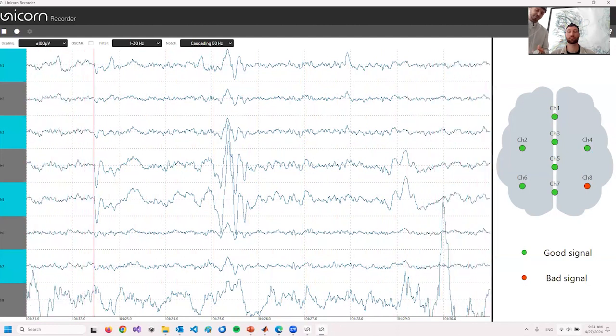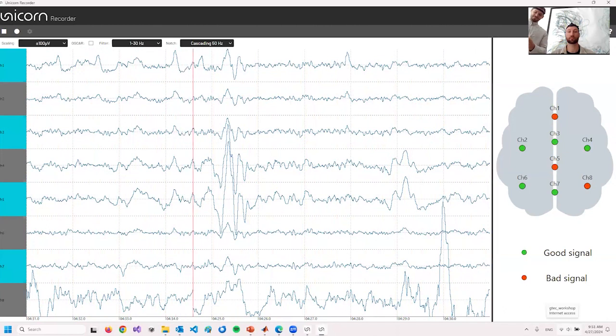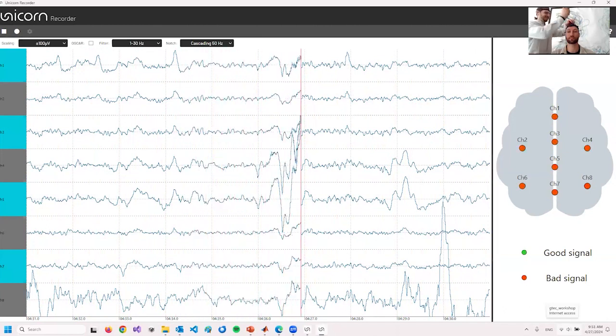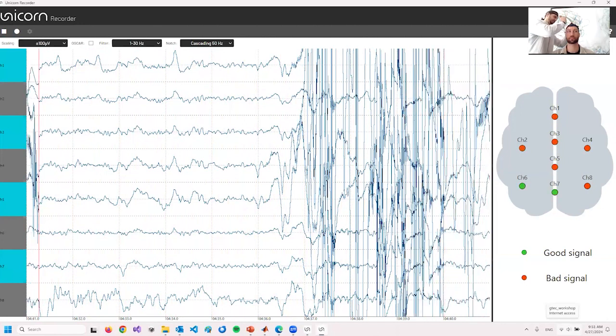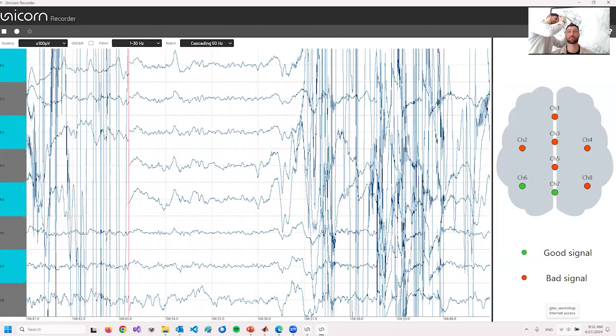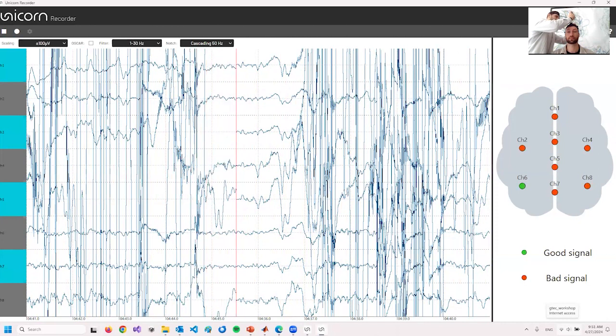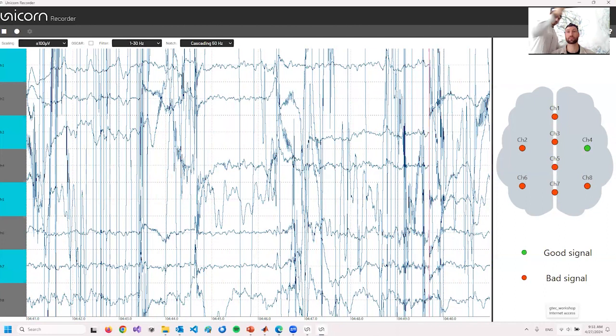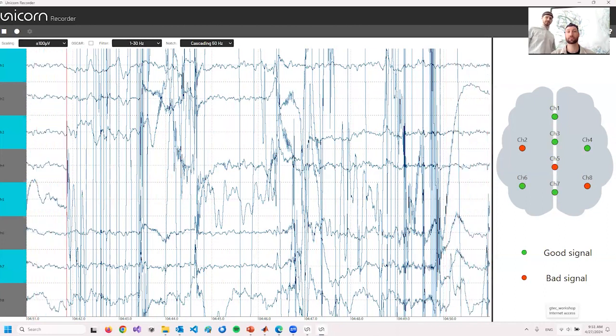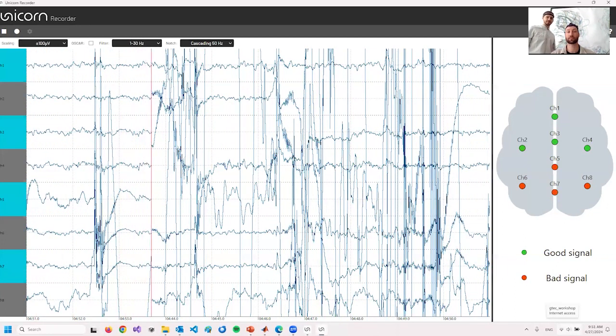So right now I'm putting some gel into my syringe. And I'm going to add some gel to the first 4 electrodes. And we're going to wait till the signal becomes good.